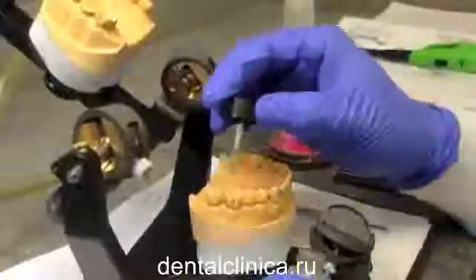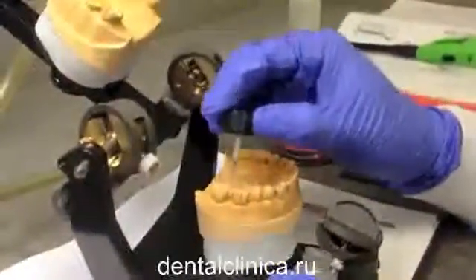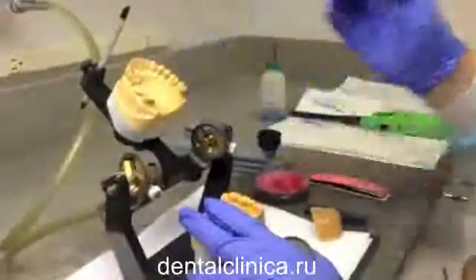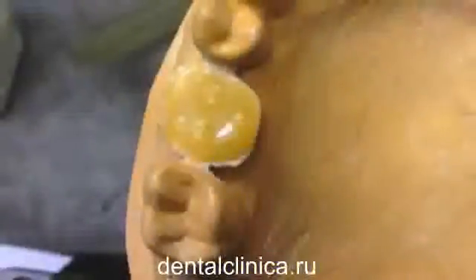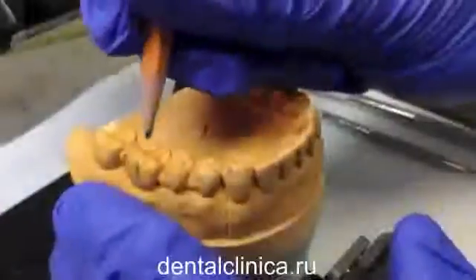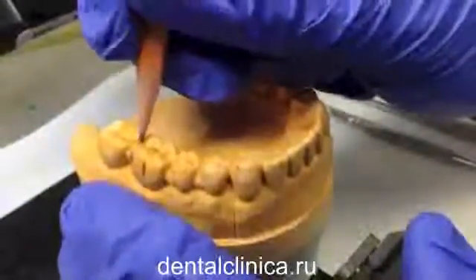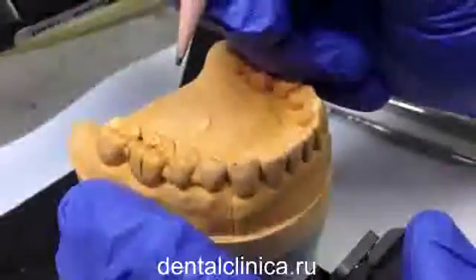First step would be to apply a separator to the opposing surfaces. Next, add a thin layer of sticky wax to the platform of tooth number 3. Next, mark the receiving areas on the mandibular molar for the supporting cusps, also known as the stamp cusps.